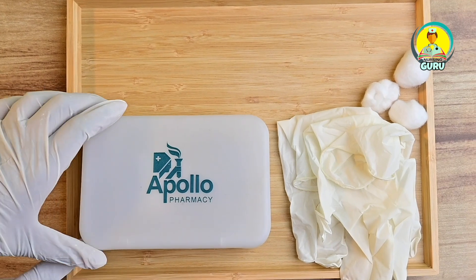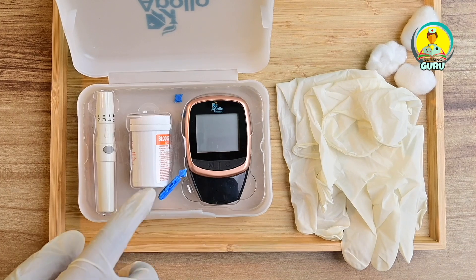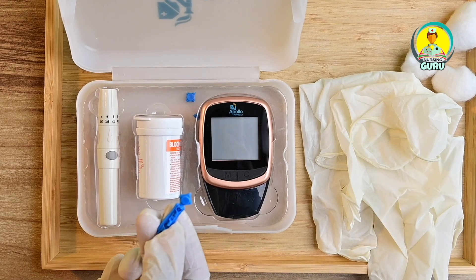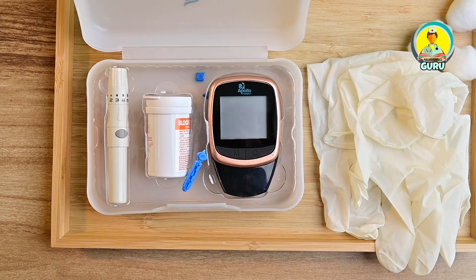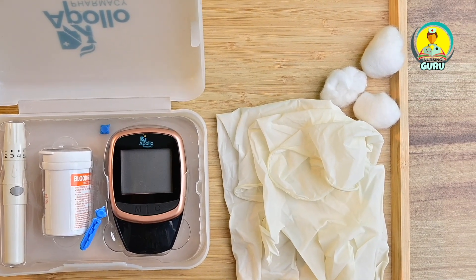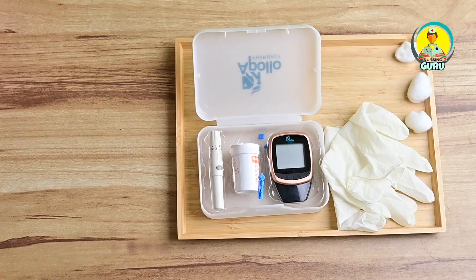Now let's check how the procedure is going to work. First of all, arrange all the articles near the patient's bedside. These include the sterile lancet, lancing device, sterile strips, disposable gloves, cotton balls, and glucometer. Everything has to be arranged near the patient's side.